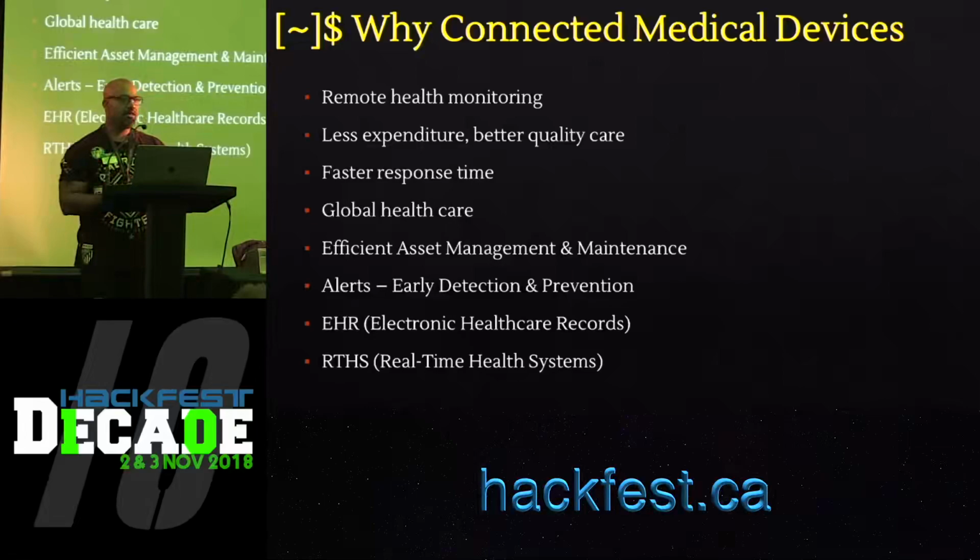It's got some safety features built into it. So medical practitioners can set soft and hard limits on an infusion pump. So for example, a doctor can come in and set morphine to be 100 milligrams as the maximum limit. And then once that is set, even if the patient wanted to inject more morphine, they won't be able to. It used to be a standalone device, but now it's connected to the network.